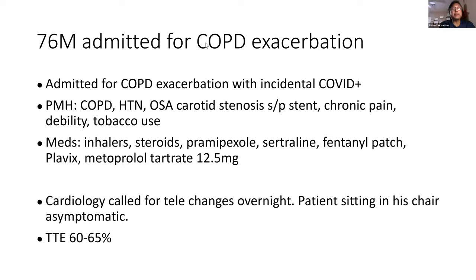Another patient, a 76-year-old with incidental COVID, but coming with a COPD exacerbation. Cardiology was called in for tele changes overnight. This is the EKG in the beginning, and then this problem.